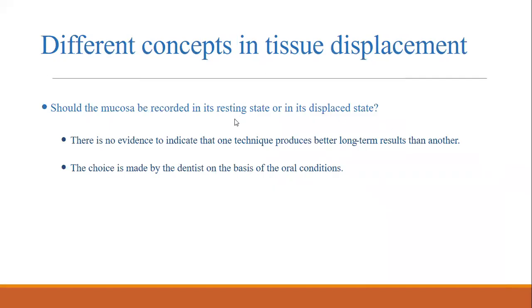Has a different concepts in tissue displacement. Should the mucosa be recorded in resting state or in displaced state؟ هون في عندنا concepts مختلفة. يعني ناس بتحكي mucocompressive، ناس بتحكي mucostatic. There is no evidence to indicate that one technique produces better long-term results than the other, but the choice is made by the dentist on the basis of oral conditions.